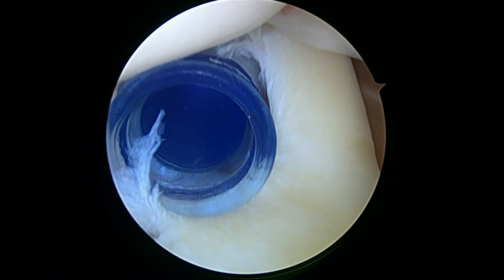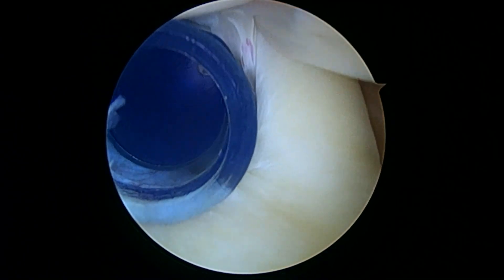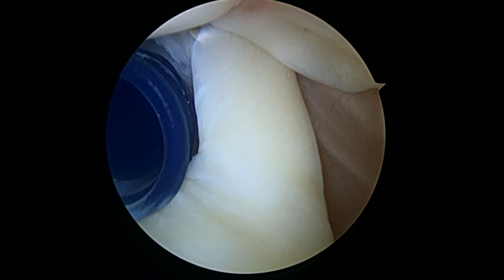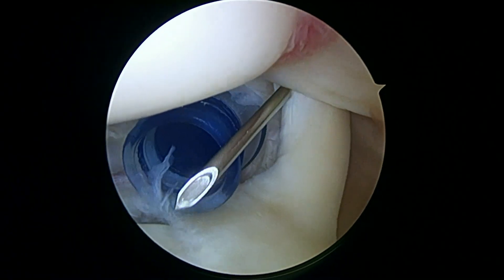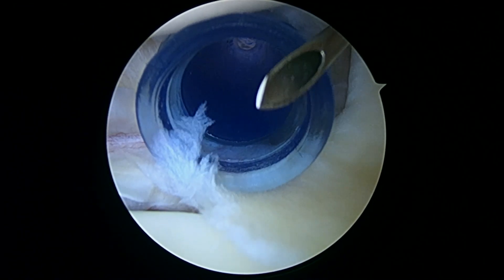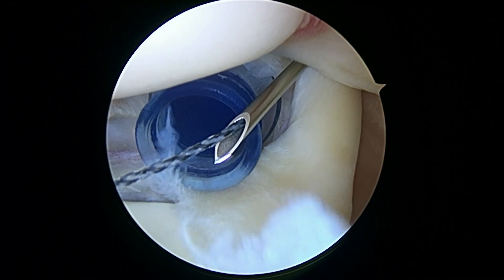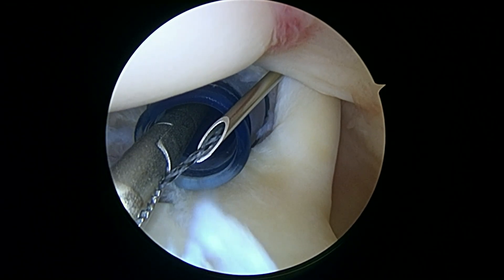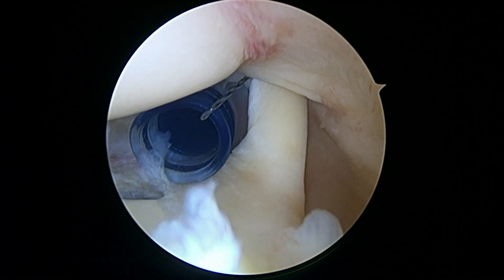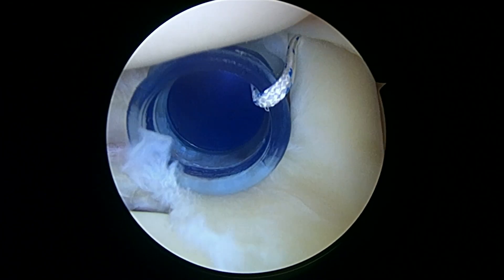We'll take a spinal needle first — this is going to be our initial pass through the biceps just so we can secure it. There you can see how we get right through the tendon, and we're going to pass a black wire called the super shuttle through that. This is what we're going to use to pass some suture. Now we're going to load that wire with a stitch. There's the first pass through.